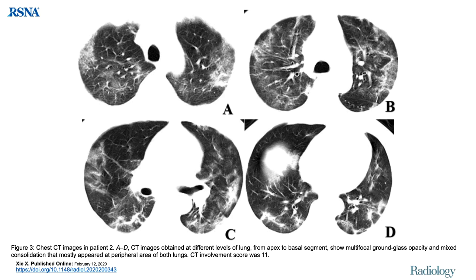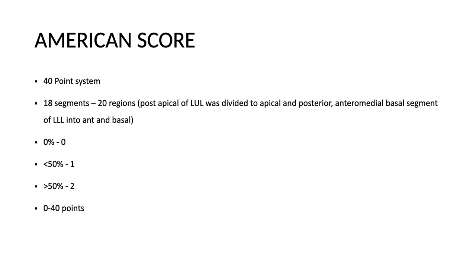This CT scan from apex to base of the lungs shows multilobar involvement with a CT involvement score of 11. There is also an American scoring system — a 40-point system using bronchopulmonary segments. Instead of lobes, it considers 18 segments divided into 20 regions — the posterior apical of the left upper lobe was divided into apical and posterior, and the anteromedial basal segment of the left lower lung into anterior and basal. Zero percent involvement scores 0, less than 50% scores 1, greater than 50% scores 2 — total 20 regions, maximum score of 40.